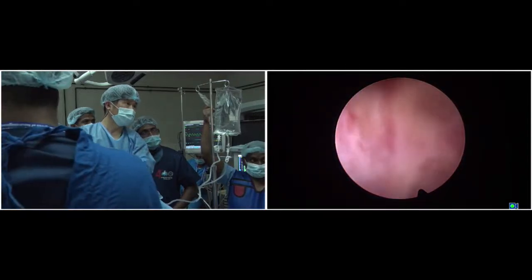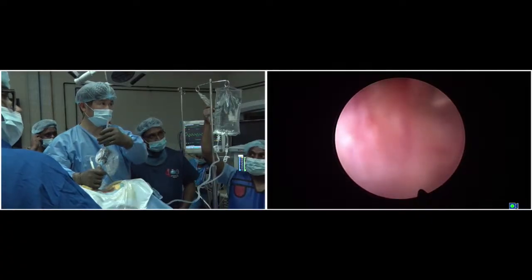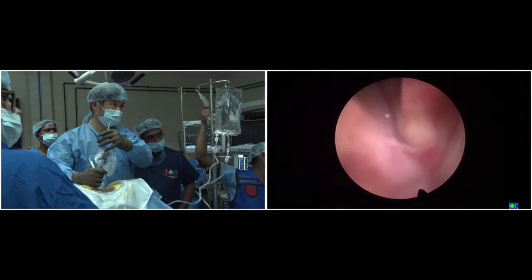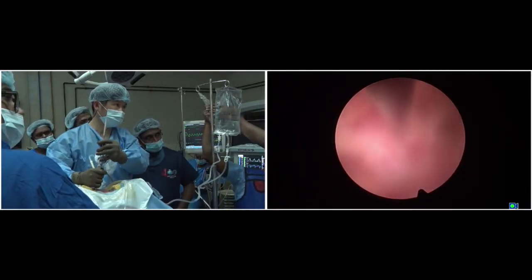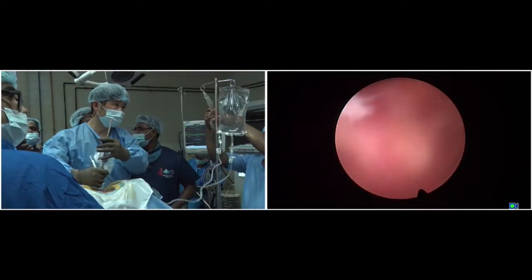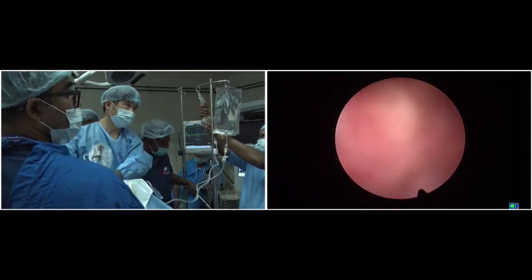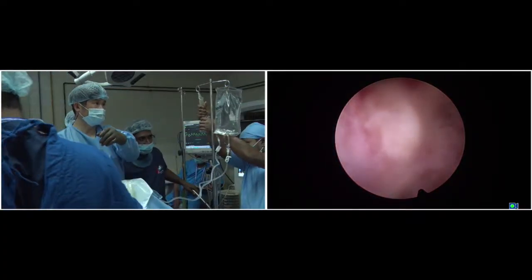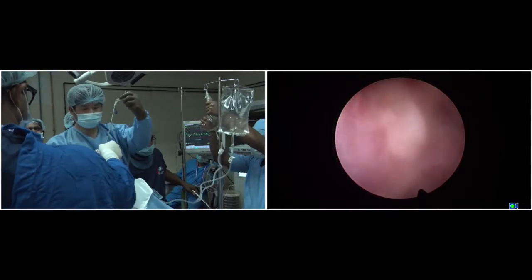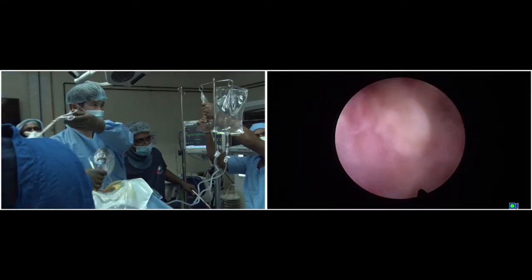Hook. That is a ruptured disc. Yeah. That is not good for me. This is the disc. Yes. Hello, audience. Can you hear? Yes, this is the disc. You can see the disc is protruding out. Not so good for my operation. This is the last of this operation, actually. Small scope. Small.